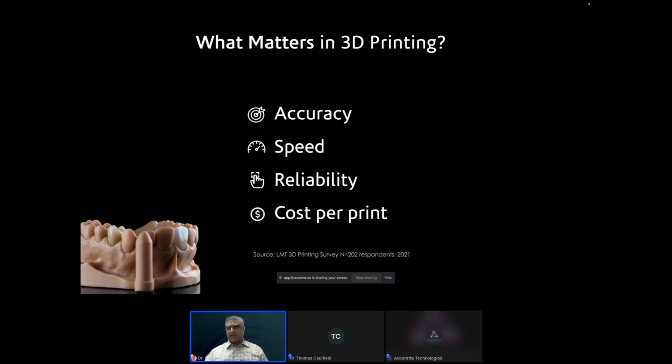I mean, think about it. A surgical guide is under $10. A crown, for instance, is under $3 perhaps. Something like a denture is again under $10. So, you're looking at really, really low cost production compared to many other conventional costs of production in dentistry.